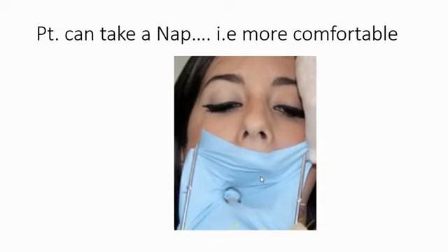Patient can take a nap. Yeah, patients are very comfortable. ठीक है. If you are comfortable in placing the dams and you are trying to tell the patient the advantages, and when the procedure starts the patient can rest. You don't remember when you used to do your procedures by using a bite block.